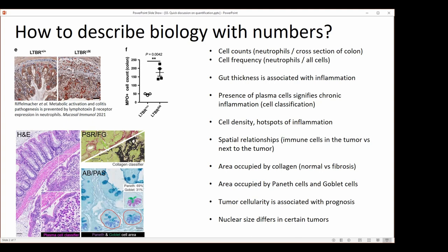During our training course, we looked at parameters such as gut thickness, which is often associated with inflammation. We can look at the presence of plasma cells with an object classifier, which can signify chronic inflammation. From those densities of cells, you can get to some hotspot analysis. There is also a lot that can be addressed within the spatial relationships — for example, immune cells in the tumor versus immune cells next to the tumor. When we think about fibrosis, we will often express this as an area occupied by collagen, and that's going to be higher in fibrotic conditions versus normal conditions.